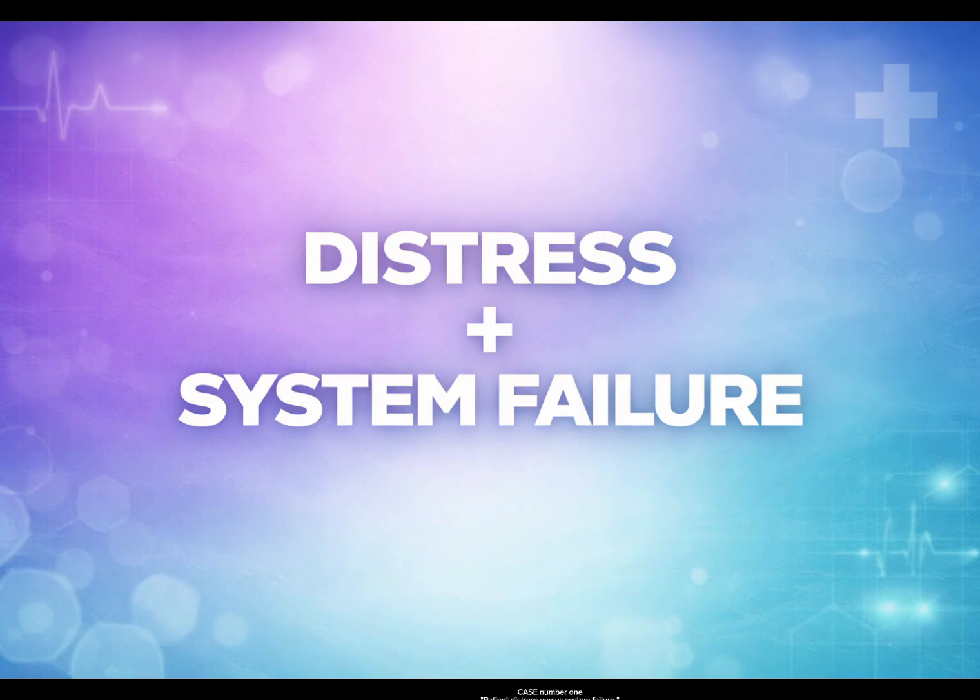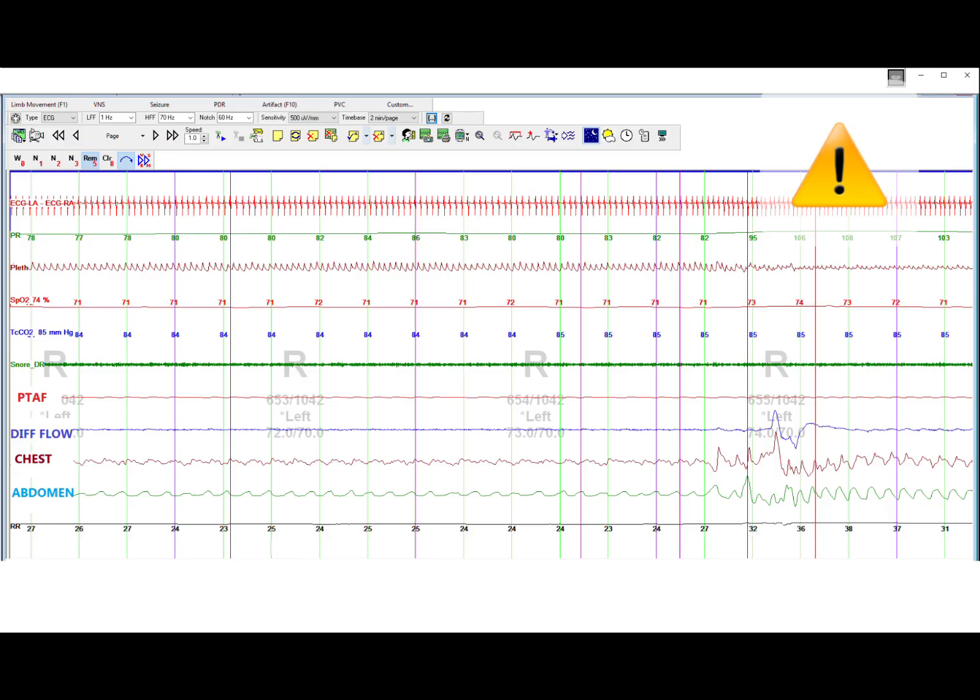Case number 1, patient distress versus system failure. In this example, both airflow signals are absent, while respiratory effort is still present. At the same time, the patient is showing significant desaturation and rising CO2. This indicates not only a system issue, but also active patient distress.